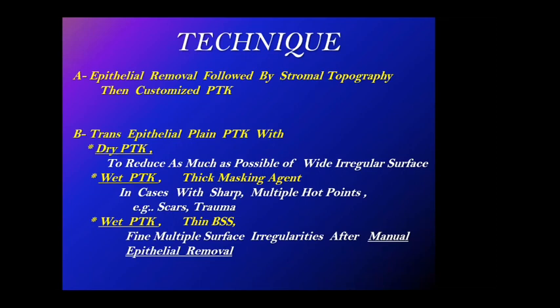We said the shape is affecting topography. So we do topography guided treatment. It's not wavefront. The customized PTK is in case we need to correct wavefront error. This is not wavefront. This is shape. I'm correcting the shape.